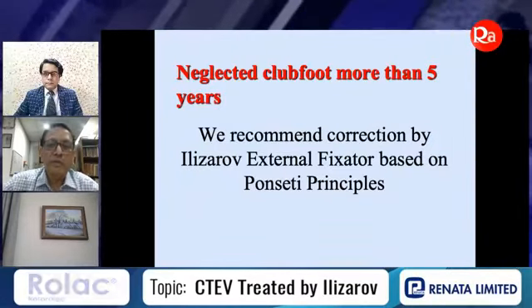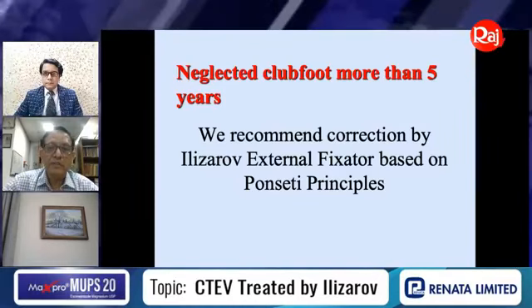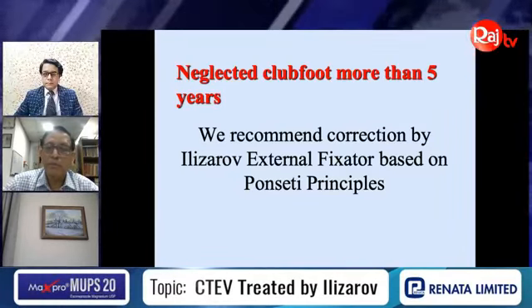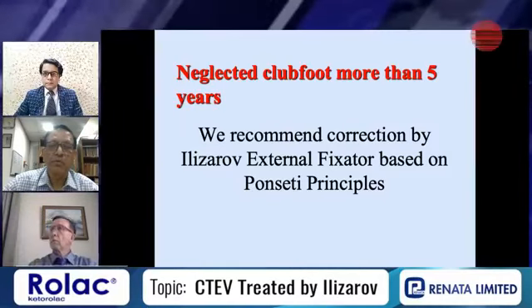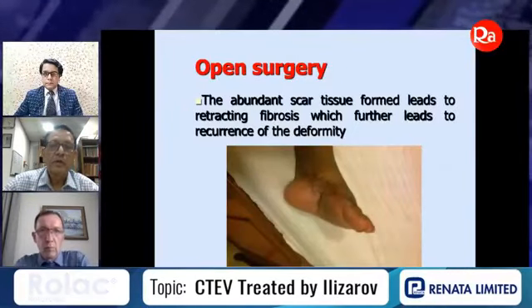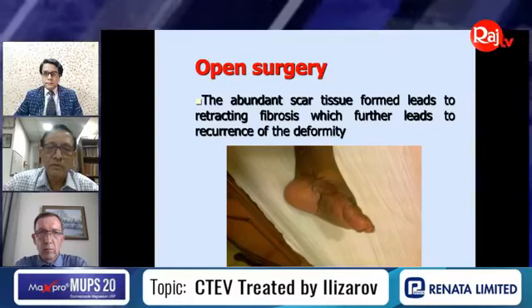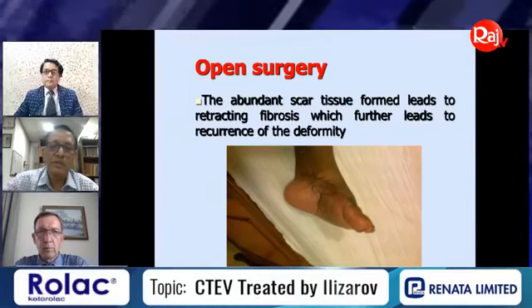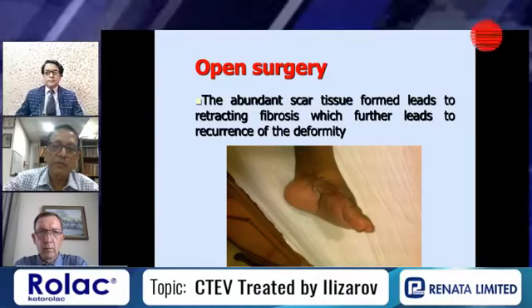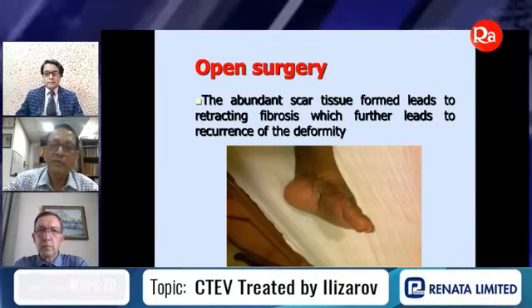Now we are dealing with the equinus correction by Ilizarov external fixation, but based on the Ponseti principles, in neglected clubfoot of more than 5 years. I was going to another city to conduct the clubfoot clinic. You can see what they have shown. This was the PMR, posteromedial release, done there.